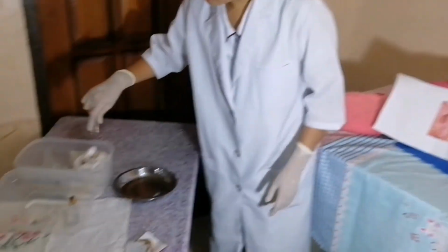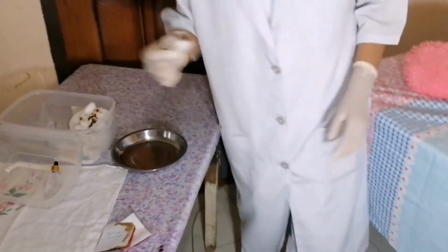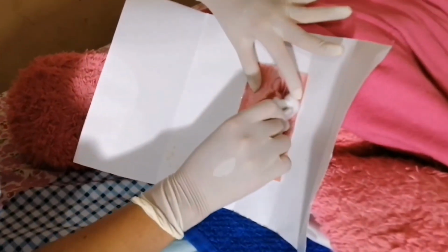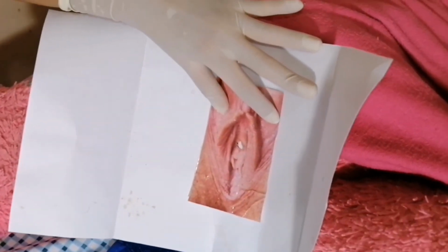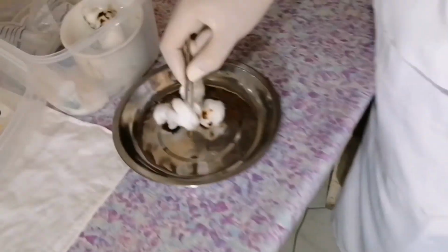With the dominant hand, disinfect the meatus twice using cotton balls with betadine. Next is to lubricate 1 to 2 inches of the catheter tube.